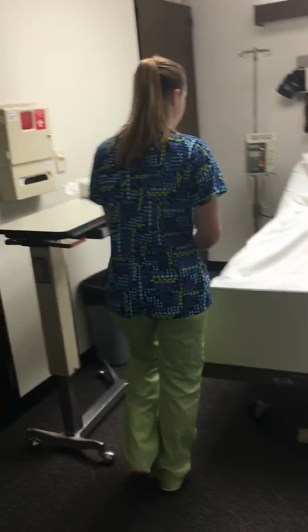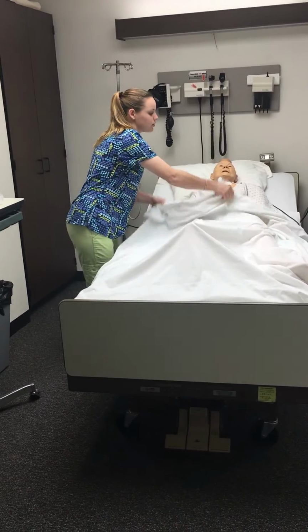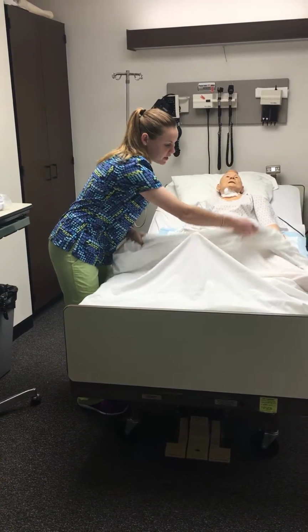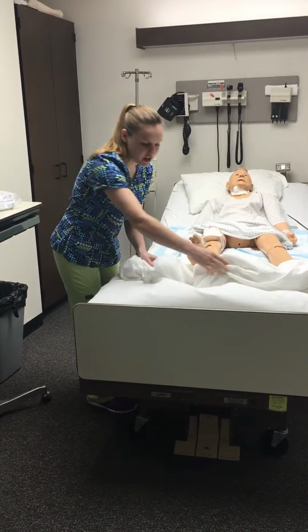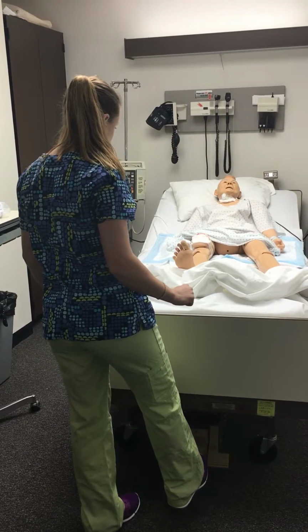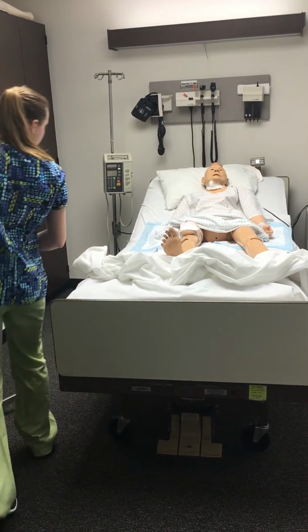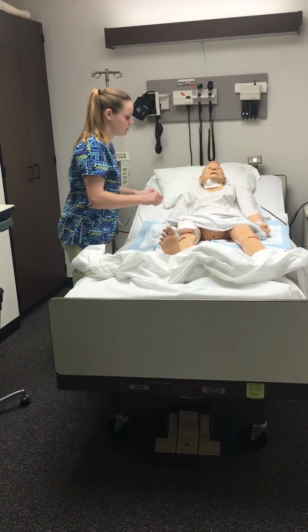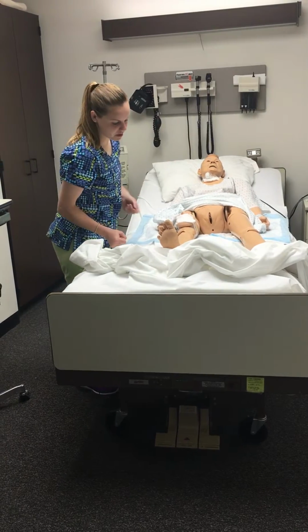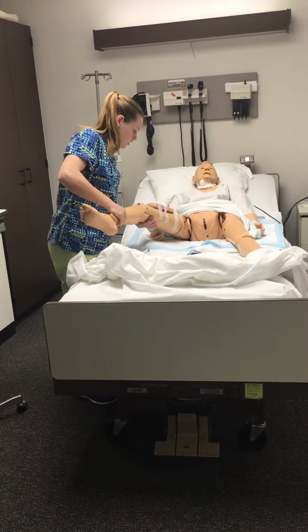So since his peri area is clean, we're gonna have to expose you a little bit, Jerry. So we're gonna roll down his bed sheet. We're gonna raise his bed to a working level. About good. And then, since his peri area is clean, we'll just roll it up. And we will get his or her legs in the position to insert the catheter.